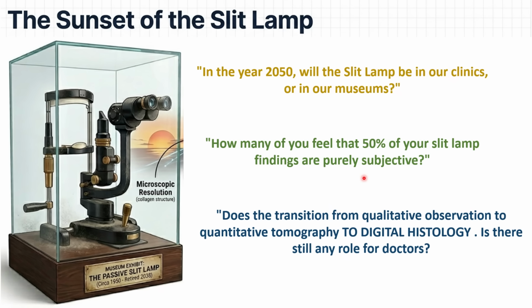impression? For example, you can see a pathology in the cornea and feel that it has, for example, a feathery appearance, while another person will say no, this is not a feathery appearance. So most of the information that we gather using the slit lamp is subjective, although it is based on our experience, the learning curve for this experience differs from subject to subject. So we might need objective information from the OCT more than the subjective information that we gather from the use of the slit lamp.